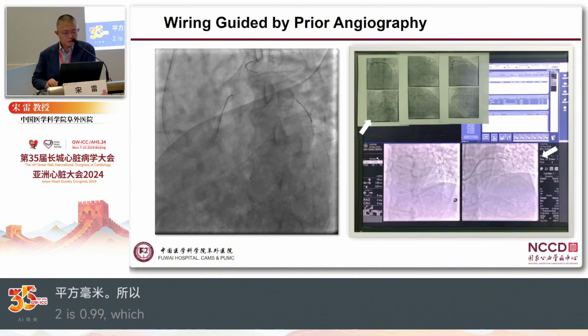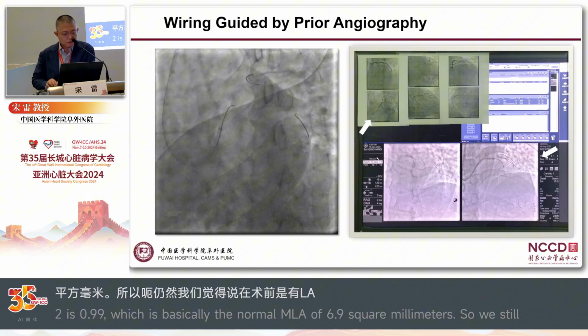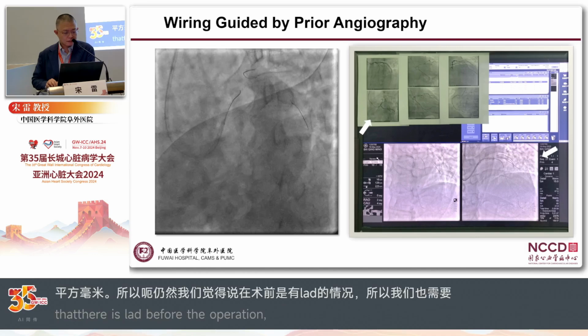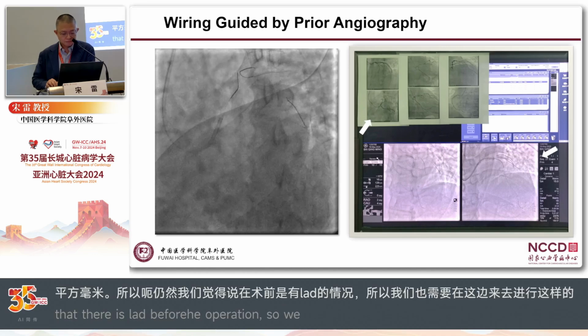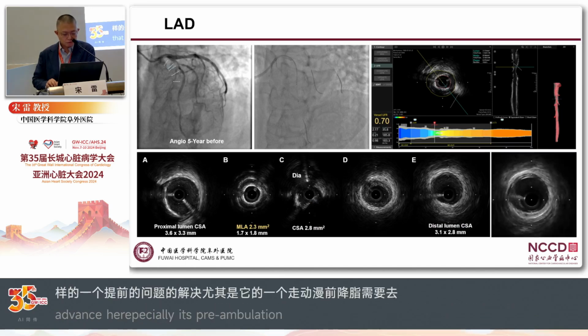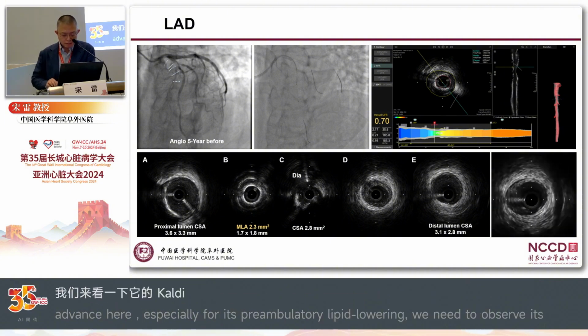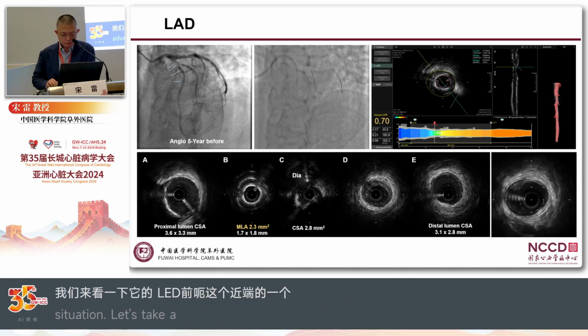We use the reference imaging to guide us to wire this patient's LAD and diagonal. And this is the LAD from distal. Distal looks good. There is some eccentric plaque.